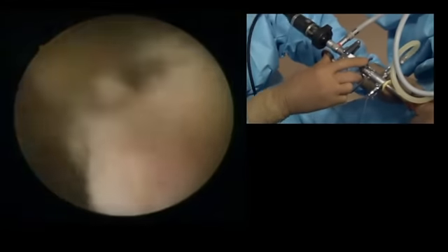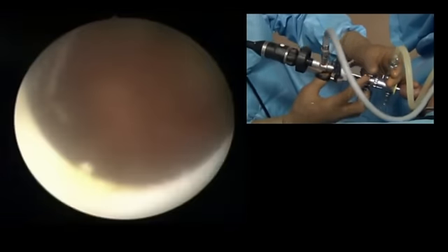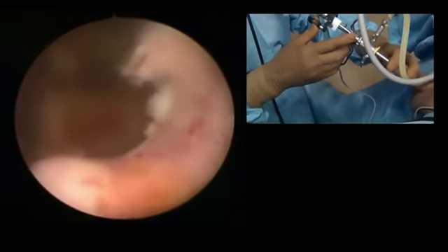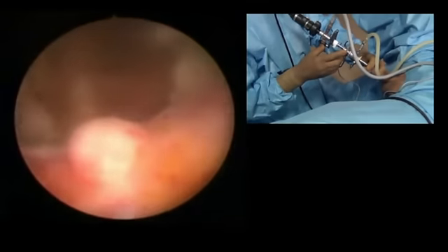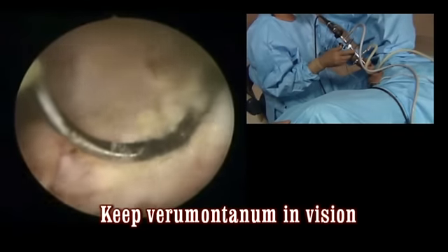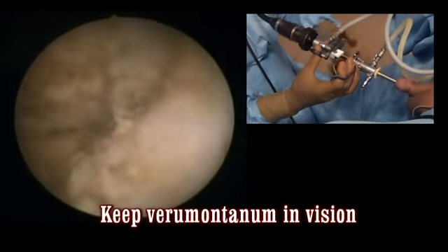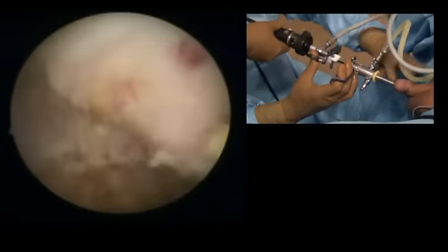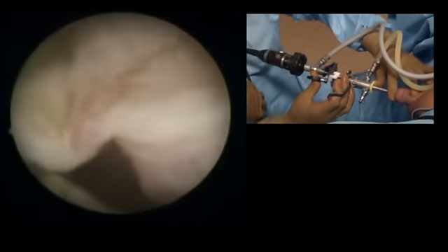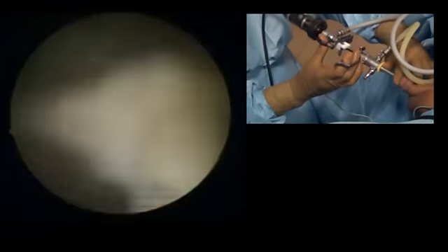It needs some bit of ballooning here. Now working on the left lobe — finishing touches on the left lobe. You will appreciate the lower limit of the resection just by the head of the verumontanum. This is anterolateral, up to the level of the apex.